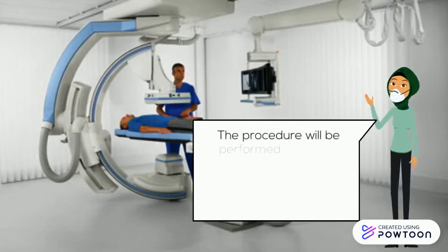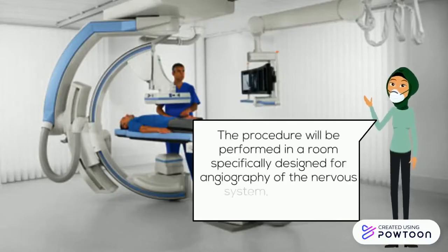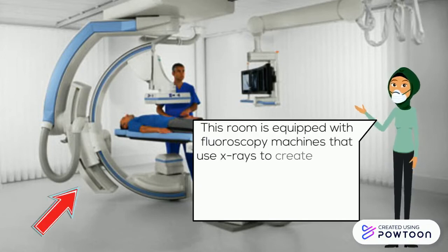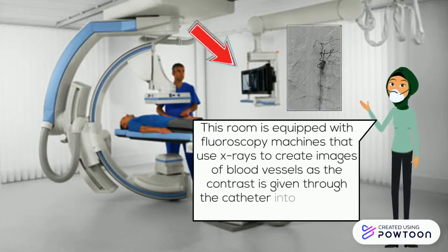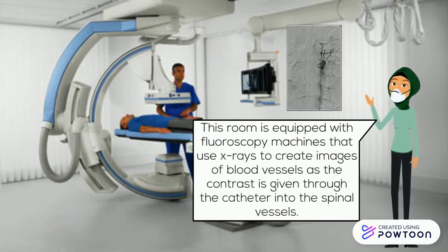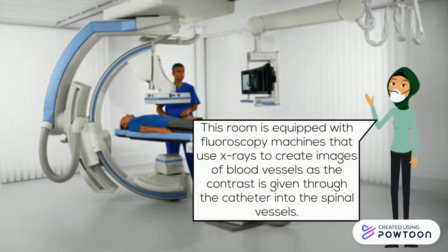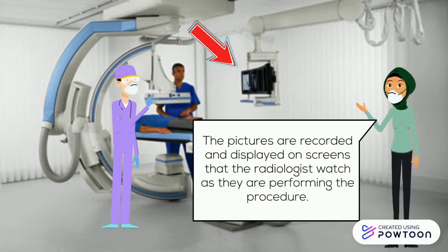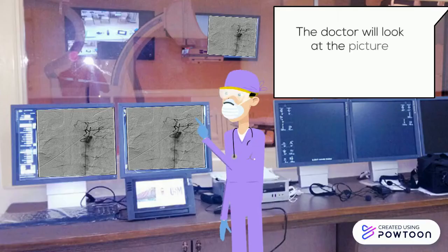The procedure will be performed in a room specifically designed for angiography of the nervous system, the neuroangiography suite. This room is equipped with fluoroscopy machines that use X-rays to create images of blood vessels as the contrast is given through the catheter into the spinal vessels. The pictures are recorded and displayed on screens that the radiologist watches as they perform the procedure. The doctor will look at the pictures more closely after the procedure.